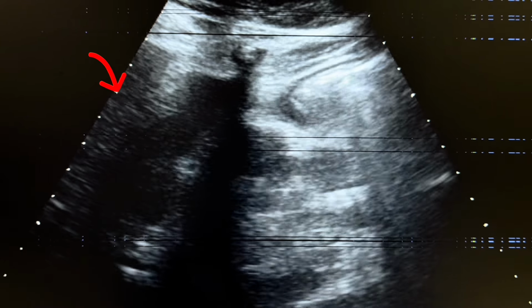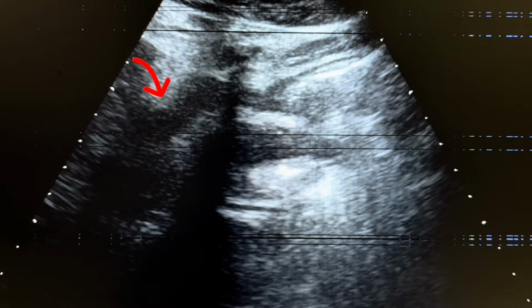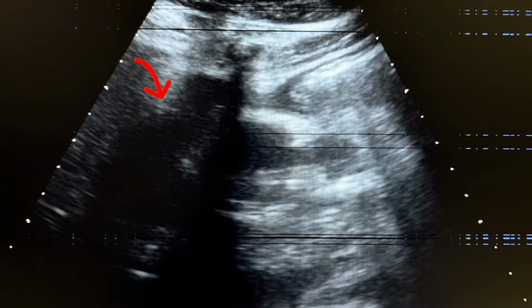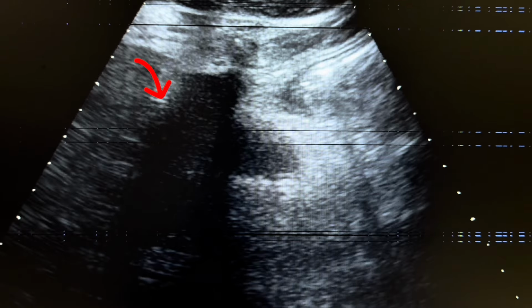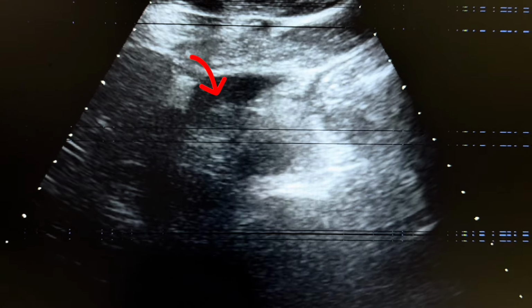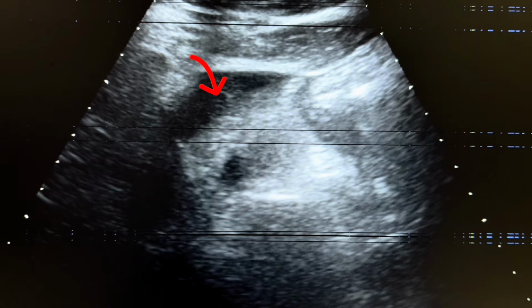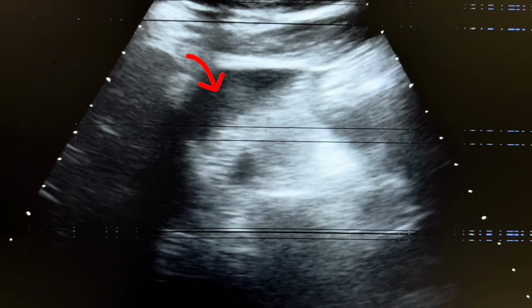Here we see the left lobe of the liver. This collection is present between the pancreas and liver. If we focus on the head and neck of the pancreas, it also shows heterogeneous texture and the margins are also irregular.